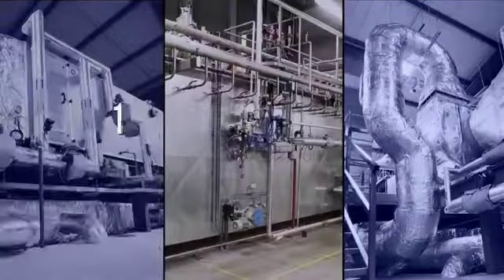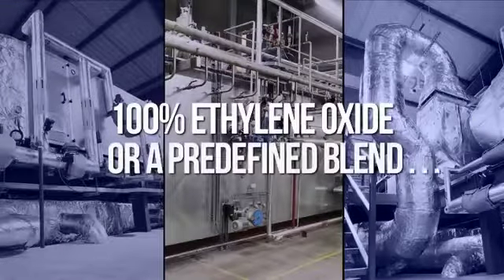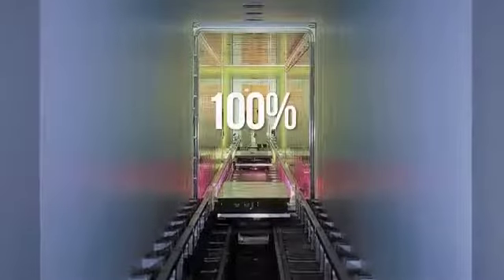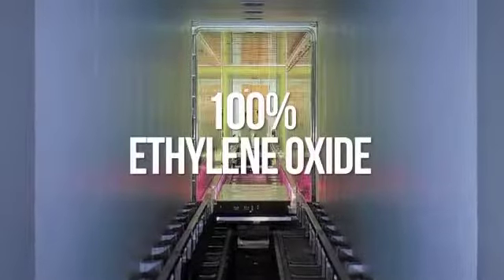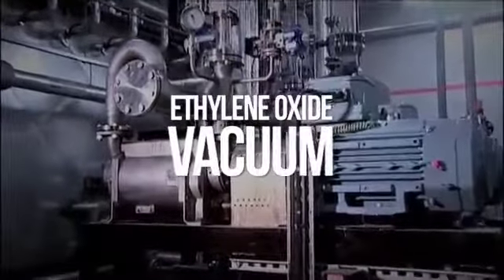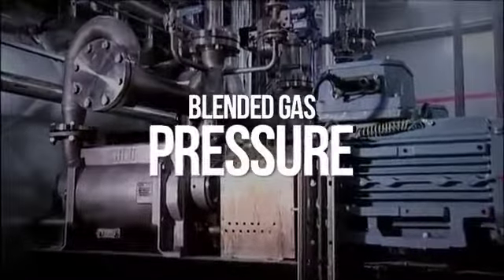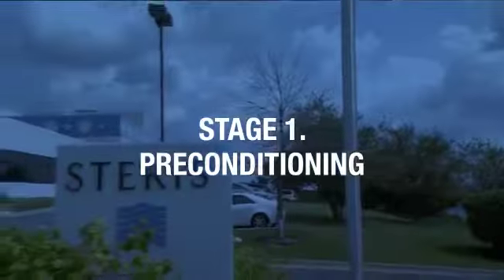Whether using 100% ethylene oxide or a predefined blend, the process is fundamentally the same. The main difference is that with 100% ethylene oxide, the sterilisation process typically takes place under vacuum, while with the blended gas, it takes place under positive pressure, typically less than 2 bar.